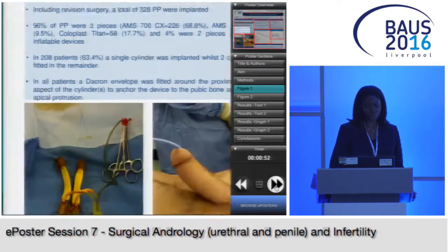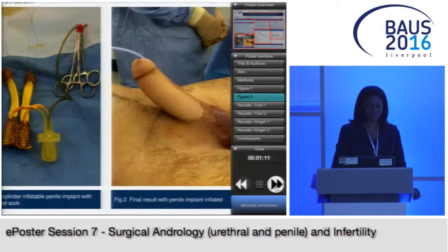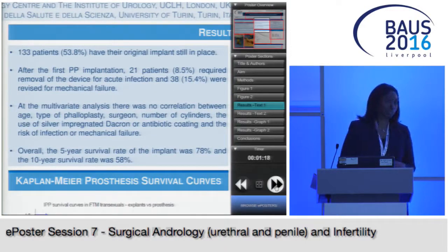All of these patients had a Dacron cap and sock attached to both the proximal and the distal end of the cylinders, and this allows both anchoring of the cylinders and also prevents erosion, as you know, these patients don't have a corpora. That's just a picture of a final result. So just over 50% of these patients had their original implant still in situ at last follow-up.